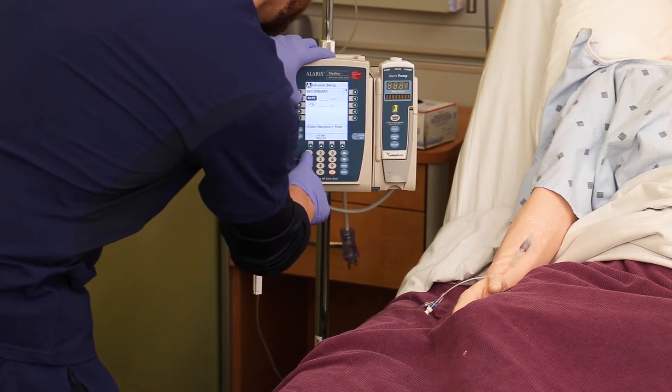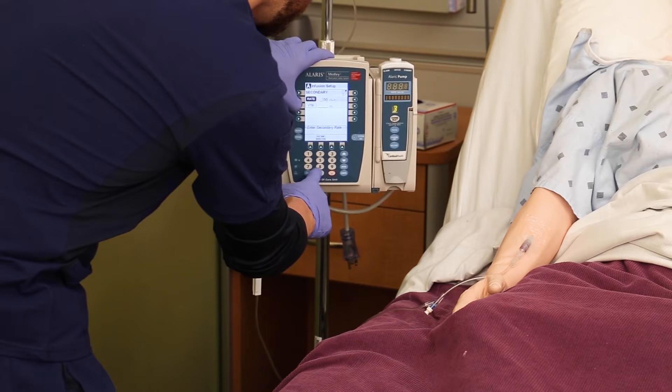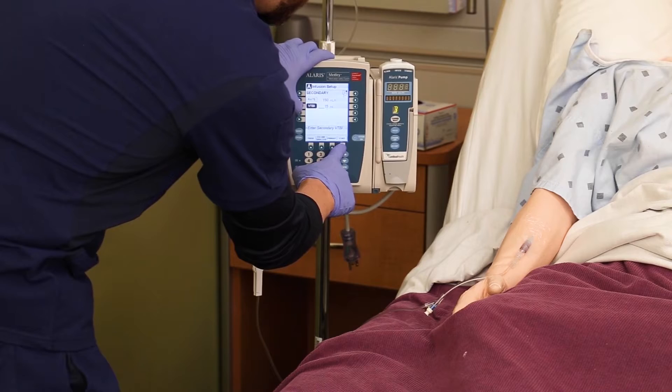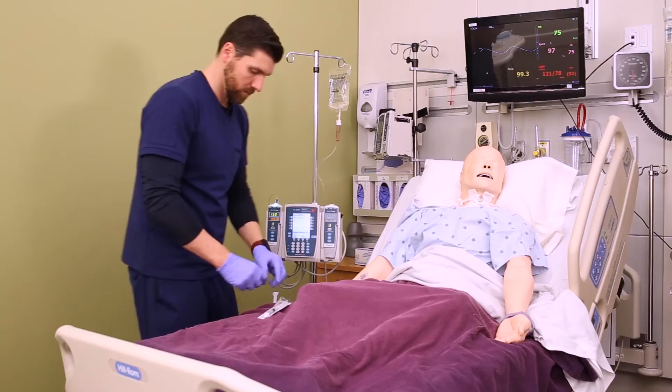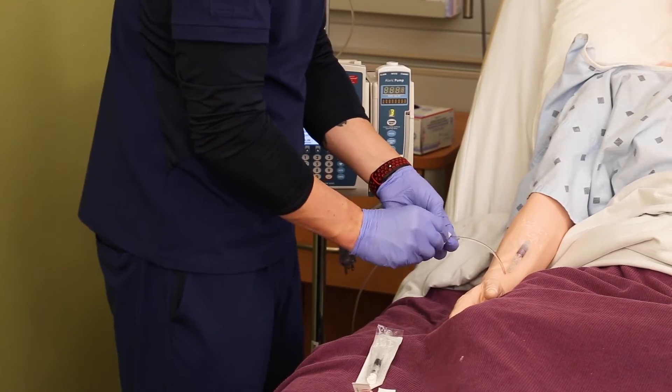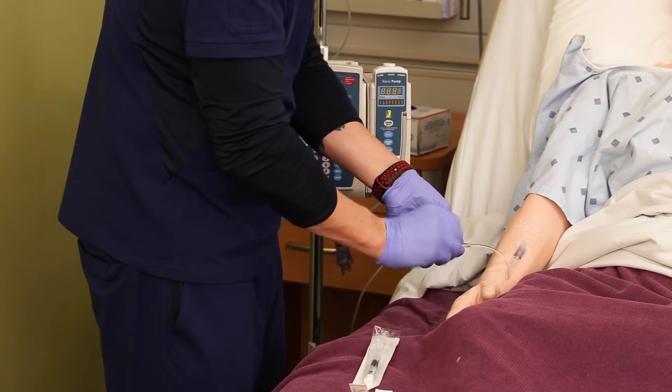Here's what you're going to do: go to your pump and program a secondary infusion. You don't have to have a secondary bag — we're just using the pump to our advantage. Set that secondary infusion to run at 150 milliliters per hour for 15 mils. That'll be a six-minute infusion, enough to flush your medicine and flush behind it.